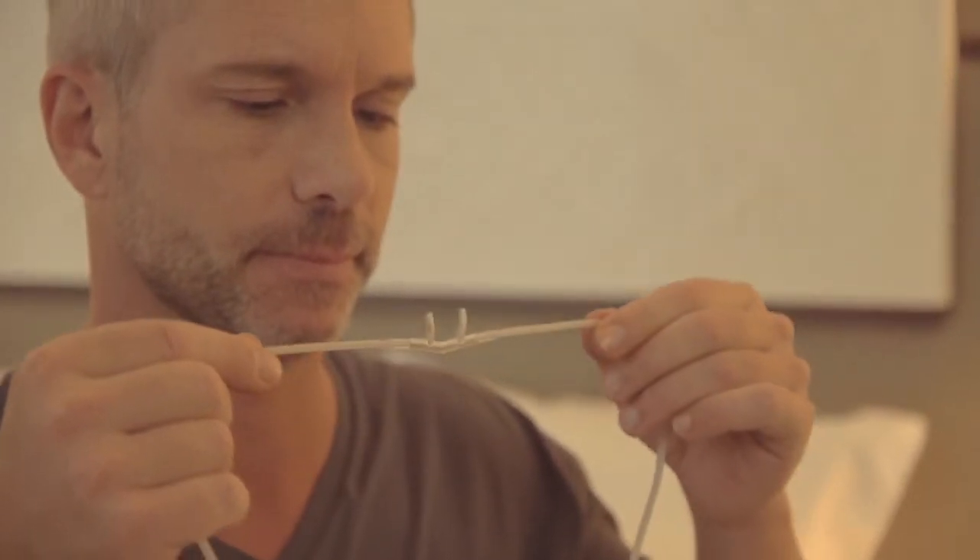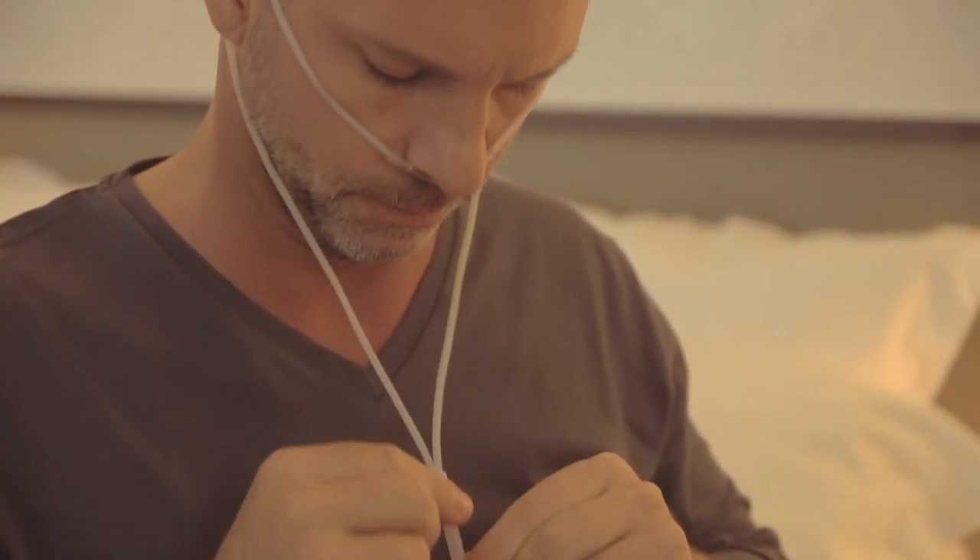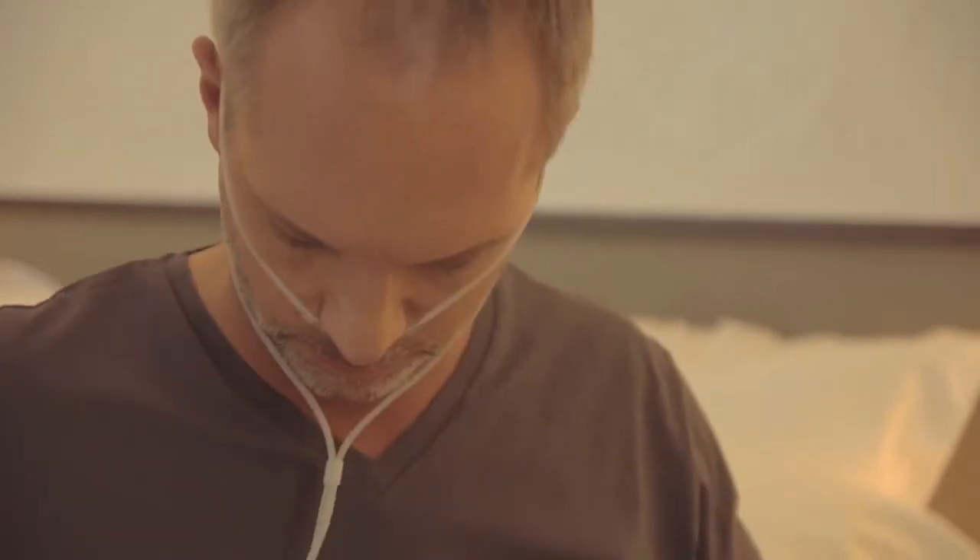Take the nasal cannula, which measures airflow, with the prongs facing downwards, like this. Loop the tubing over each ear and tighten the toggle under the chin. Make it snug but not so tight that it's uncomfortable.